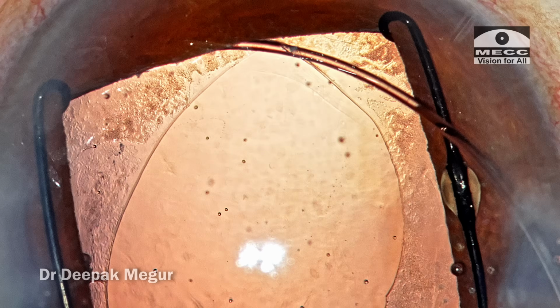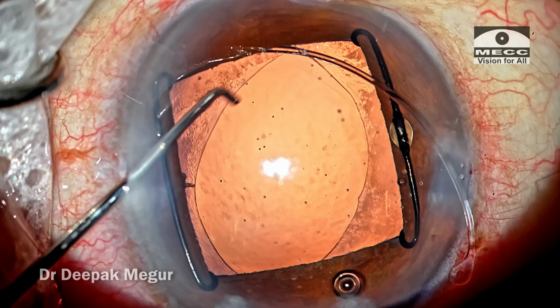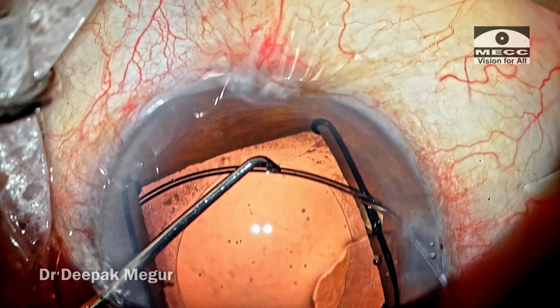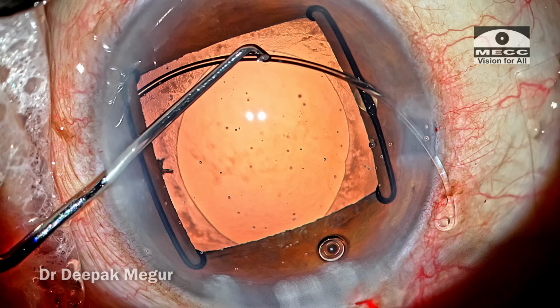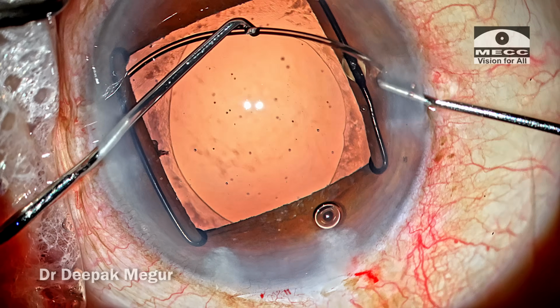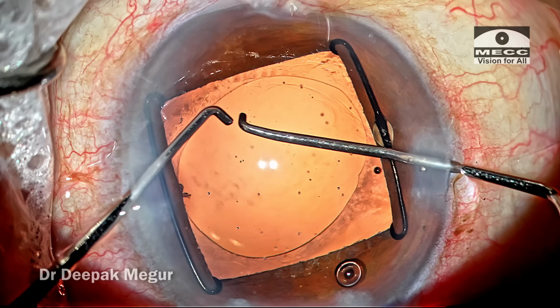This is just for the beginner surgeon to understand that it is quite probable that the CTR can also go into the sulcus above the anterior capsule. So look at the margin of the anterior capsule. If you find this is kinking, this is a confirmatory sign that the CTR has gone in the bag. The trailing end of the CTR is now gently maneuvered into the capsular bag.